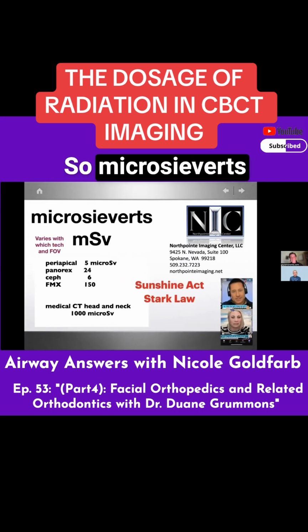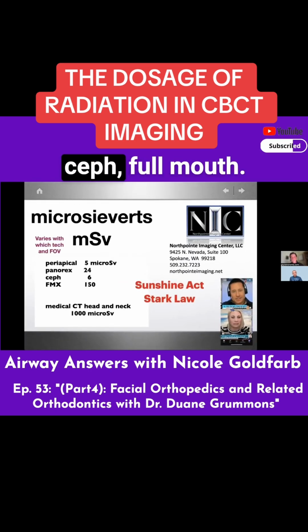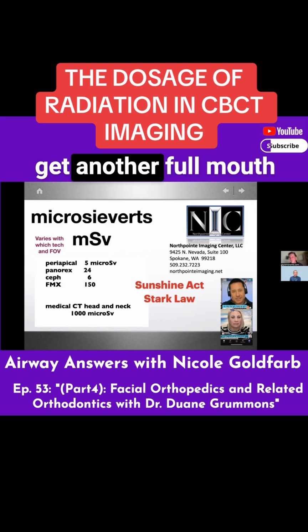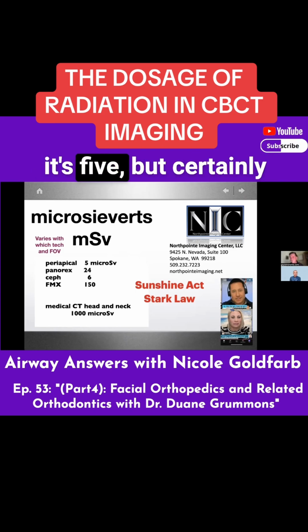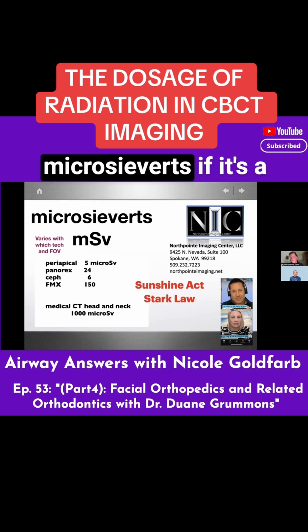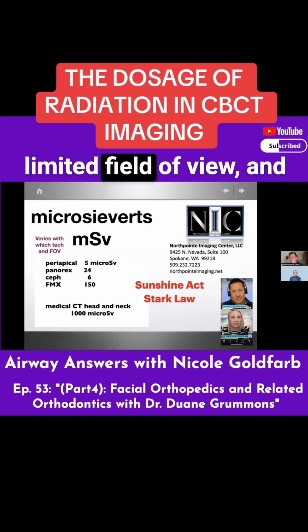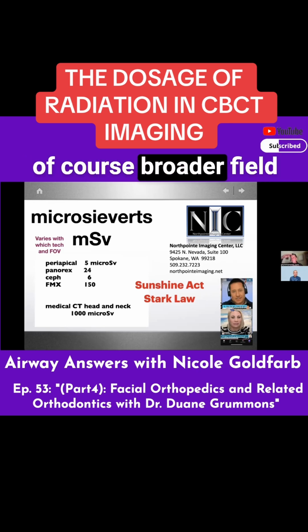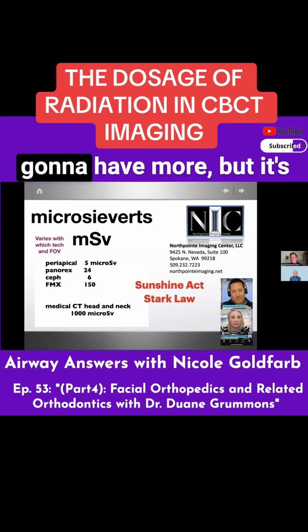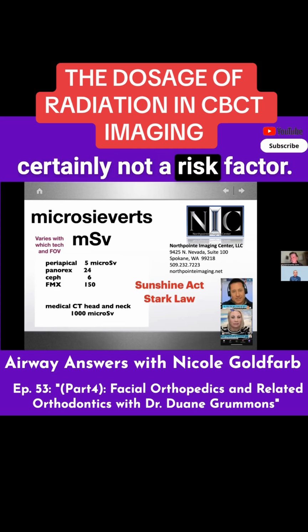So microsieverts: periapical, pan, ceph, full mouth. Look at the full mouth x-ray the dentist does that nobody hesitates with every couple of years, get another full mouth, or sometimes maybe it's 5, but certainly some regular x-rays. We can take and create ceph pan with 20, 30 microsieverts if it's a limited field of view, and of course, broader field of view for craniofacial or other things we're looking at, airway, we're going to have more, but it's certainly not a risk factor.